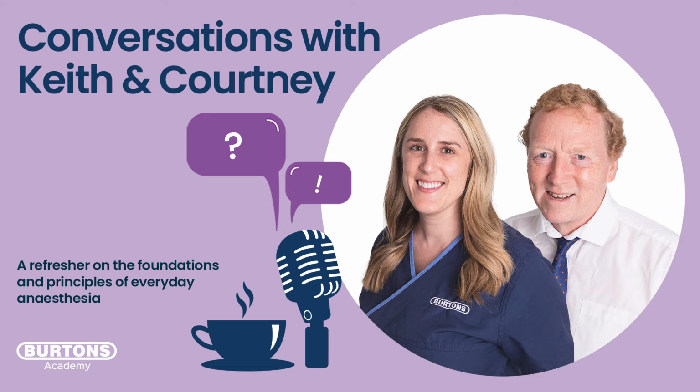So I think we have to look at everything. Yeah, and I think one of my professors at the university said one thing that always stuck with me: common things are common. So if you've got a hypercapnia, the most common thing is that the animal is hypoventilating. A very fancy word for just saying it's not breathing well enough. And by well enough, either it's not taking enough breaths per minute, or it's not taking deep enough breaths. So if we see hypercapnia, let's look for the obvious things.